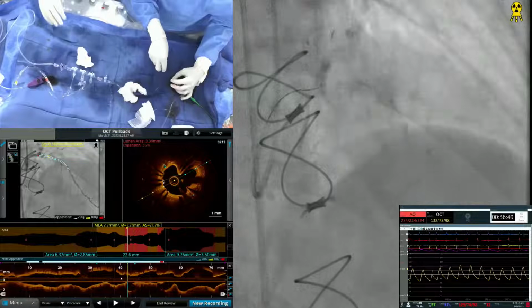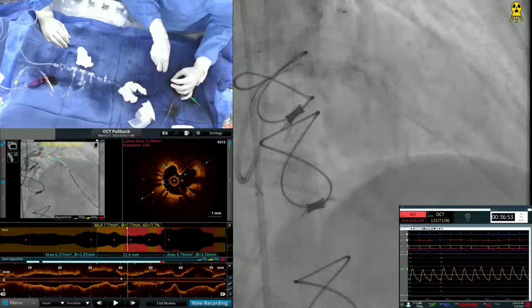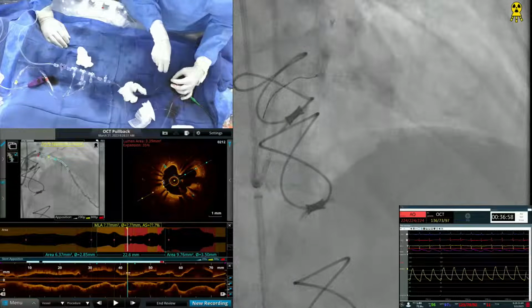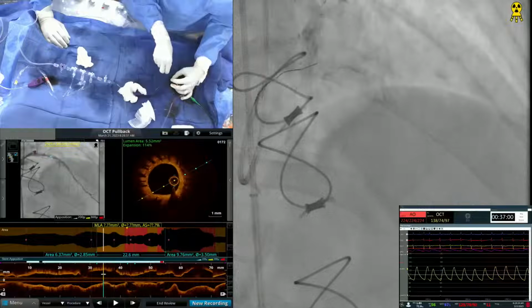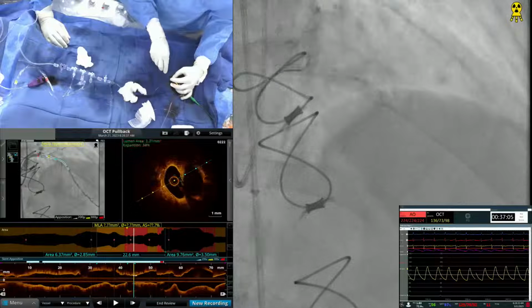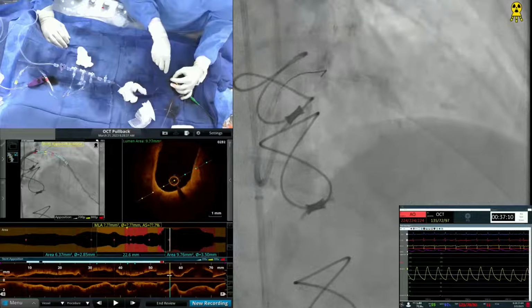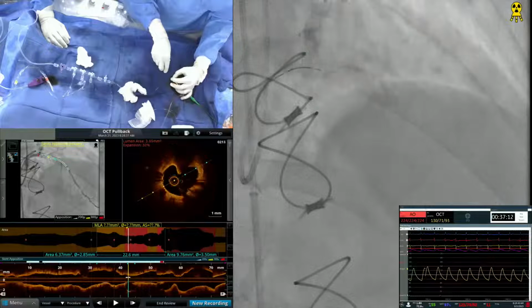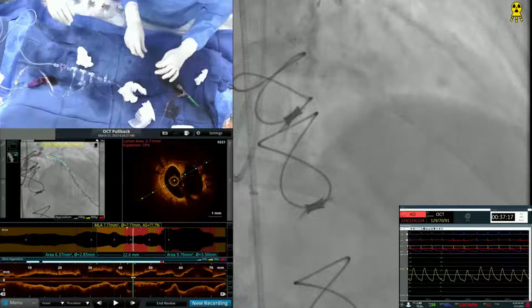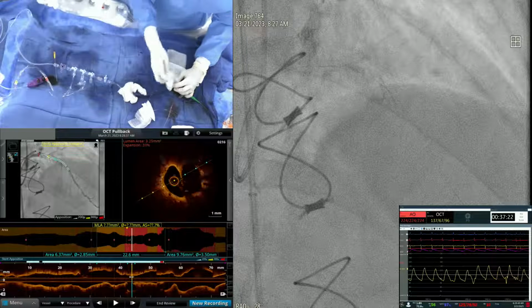Okay, now after the Rota has been done, Anu is wiring with the Runthrough wire, and the Rota wire went easier than the Runthrough. Went very easy. So here it could be also that we lifted part of a plaque or something. You could be in the top carina, or another part of the lumen, because that lumen is closed at the 1 o'clock position. That's where our diagonal is. But that's okay. We're not worried about the diagonal now.